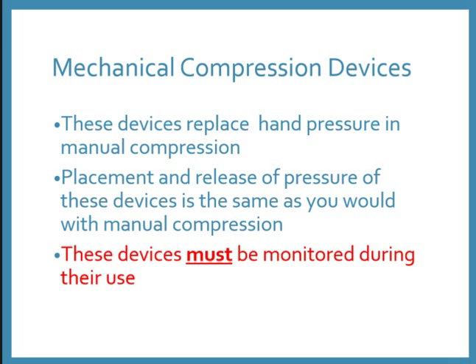So this says these devices replace hand pressure in manual compression. However, here at St. Mary's we follow the best evidence-based practices, so you should attempt to hold manual pressure first. These devices have to be monitored during their use. They can have complications just like a manual pull, such as vessel occlusion, hematoma formation, or uncontrolled bleeding.